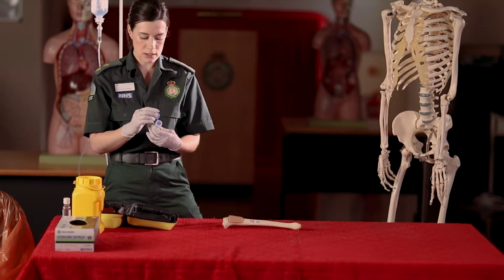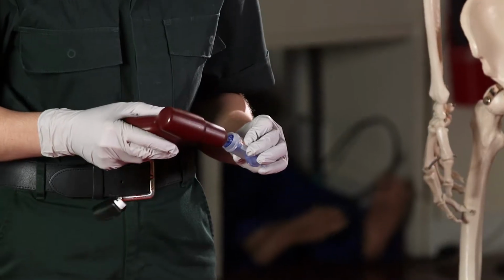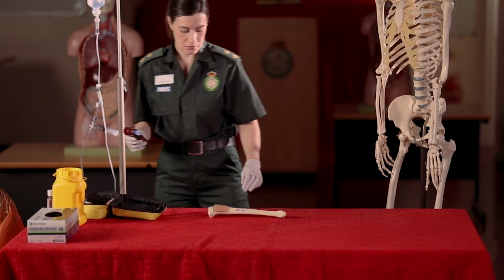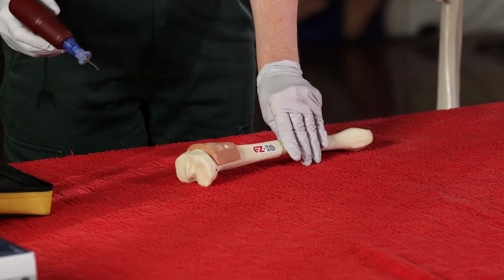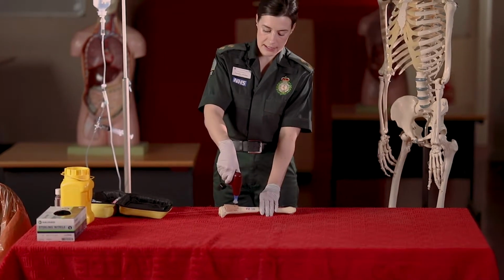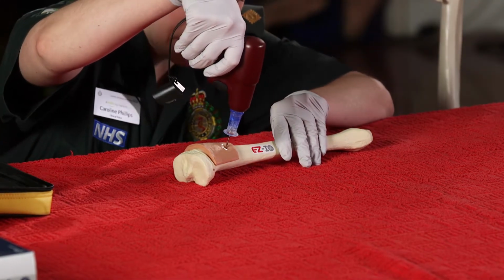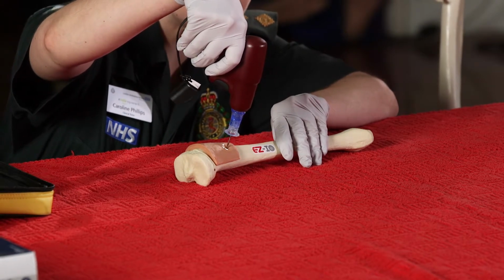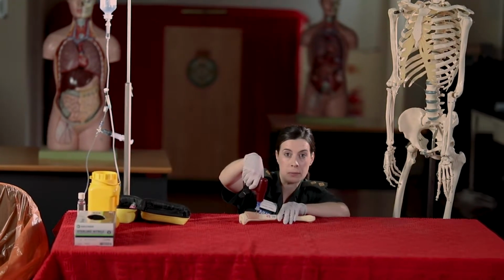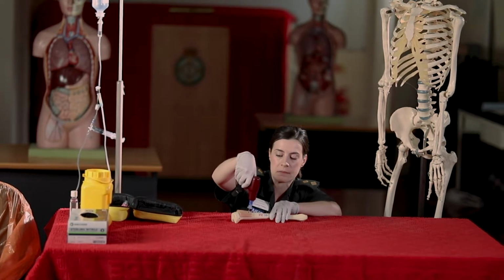So I've checked my needle, I've checked that it's in date, and I can connect it to the drill using the magnet. I'm going to puncture the site with the needle until I feel bone. Then I'm going to have a look to make sure I've got at least one black line visible. Having one black line visible means that I know that I've got some clearance to get through the site and into the medullary cavity.